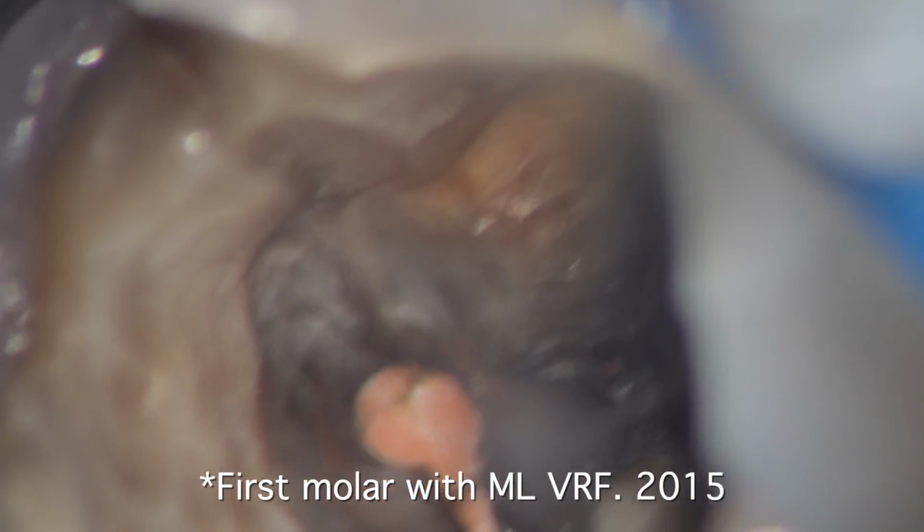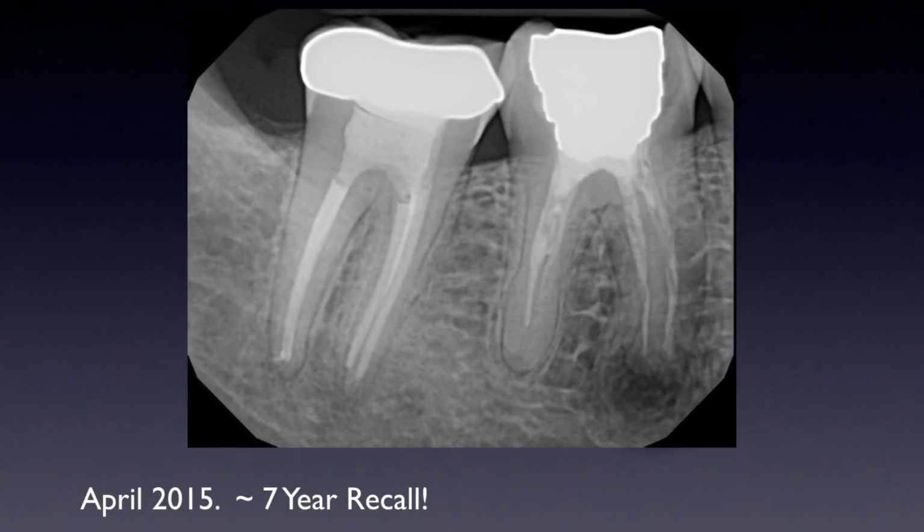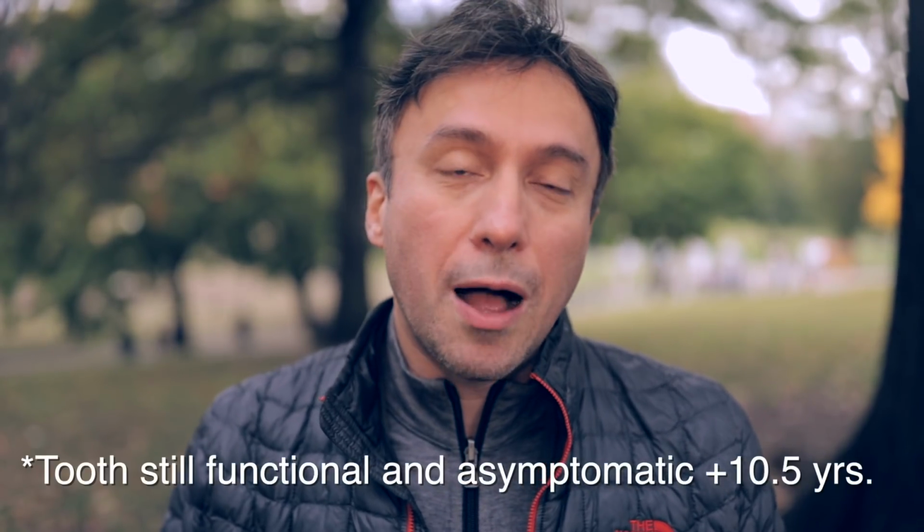But this whole experience allowed me to see this very first patient 7 years following the initial root canal and obtain this radiograph. I finally got a hold of this patient recently, but he had moved from Boston to a different state. He then confirmed over the phone that he still had the tooth and the tooth was asymptomatic and crowned and doing well.